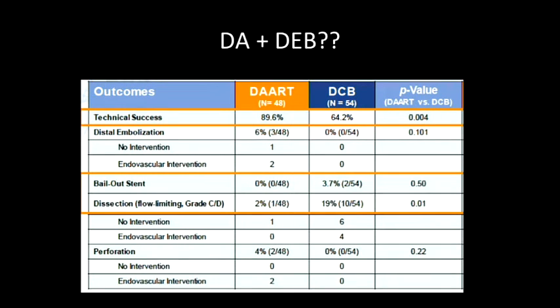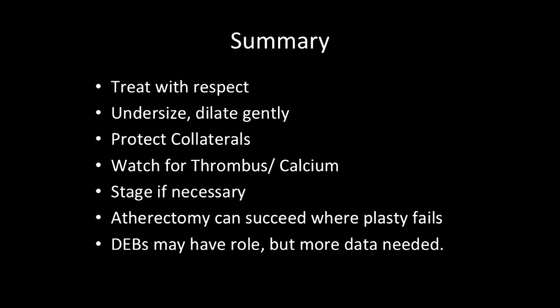It's a high risk procedure, because when the balloon is inflated, the blood flow stops, and that's a very, very bad situation to be in. We are making a dye injection to see what has happened. Flow seems to have improved. I think we'll have to keep the catheter up probably.